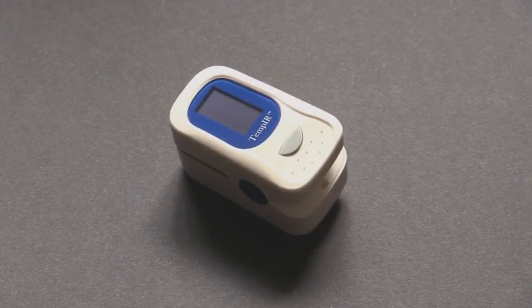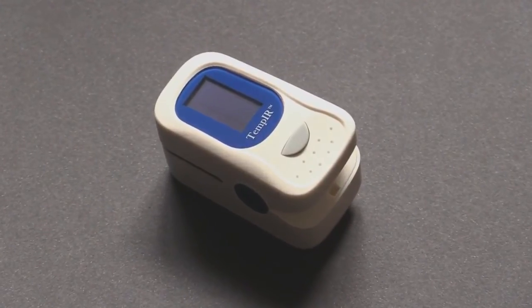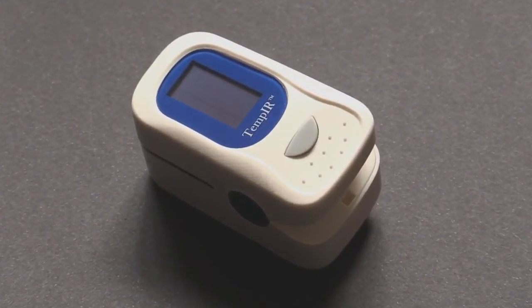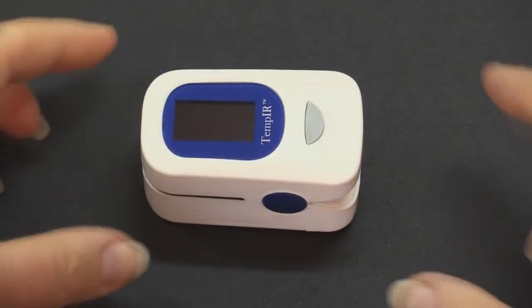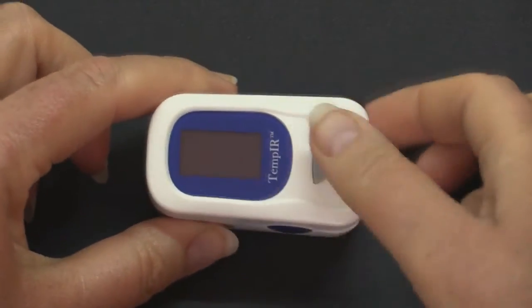The TempIR finger pulse oximeter was not designed for continual use, such as running or cycling, but it is ideal for one-off readings as a guide to SpO2 oxygen saturation levels and heart rate.